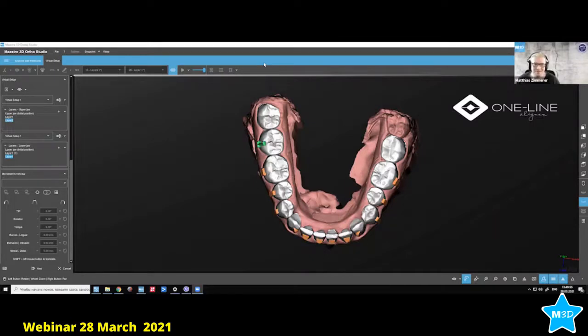Okay, so I'll be trying it next week, and I'll be posting maybe a small video or a small post about the clear aligner, if it works really, and how it feels in the mouth. So I'm going to try it on myself. How does it actually feel? And then to the patient, yes. No, I cannot try it on the patient. I'll try it on myself, and they'll see.